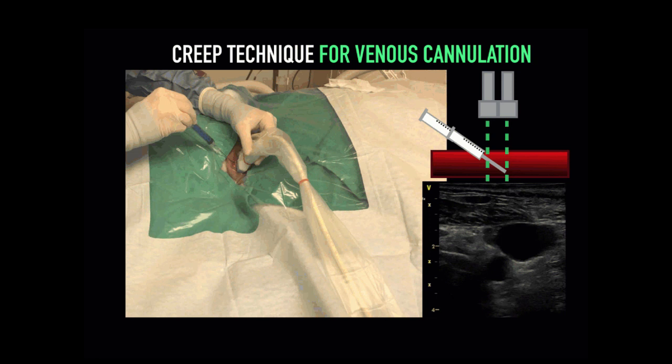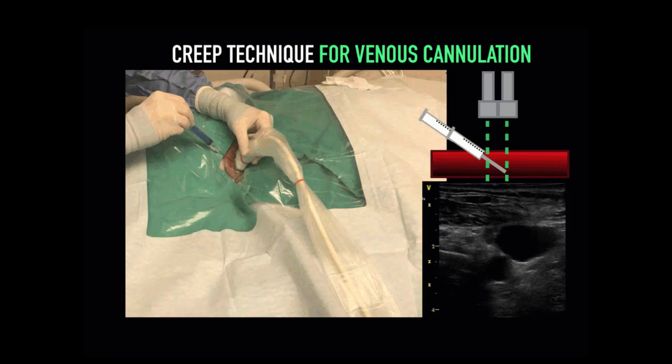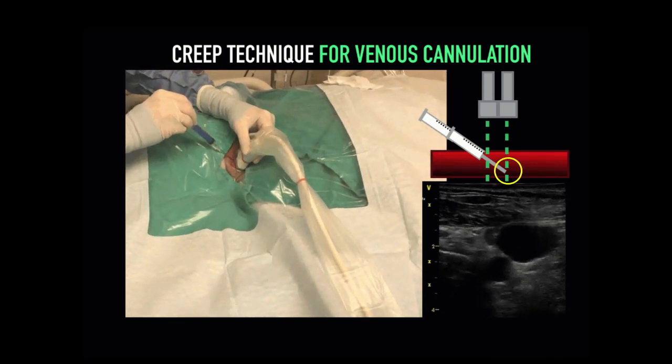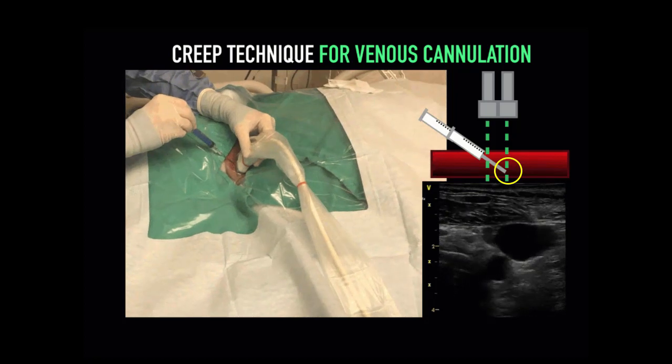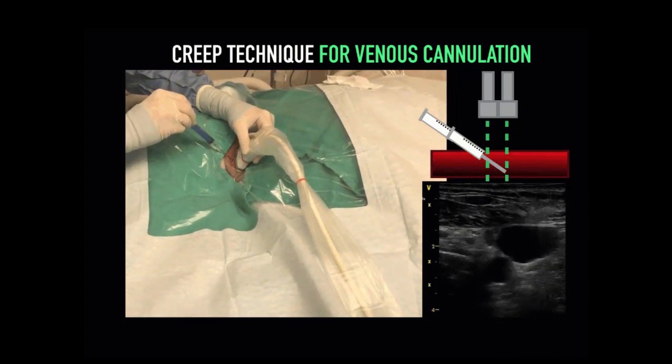Now again, we will use the creep technique for venous cannulation, and therefore we will start roughly 5 millimeters distal to our probe. As we enter the skin, we always want to make sure our probe is right at the tip of that needle as it enters. As we can see here, the person is carefully going back and forth to make sure they see the tip of the needle and not the shaft of the needle. As the needle is advanced, so is the probe to make sure, again, you are seeing the tip of the needle.